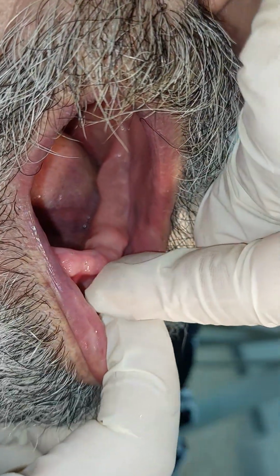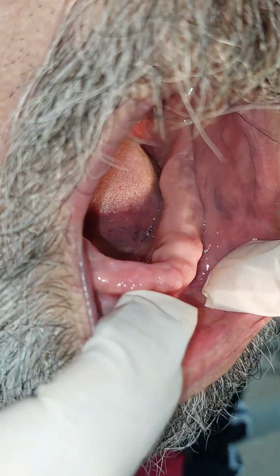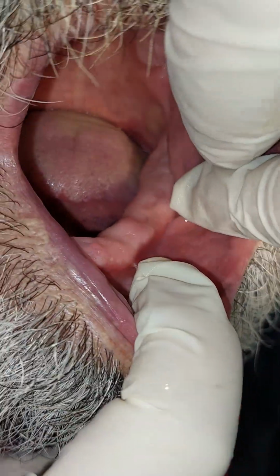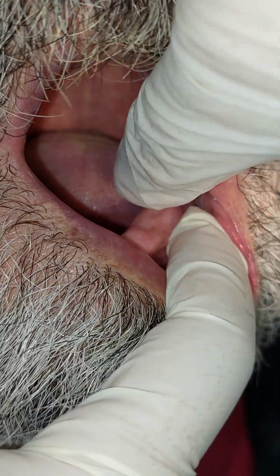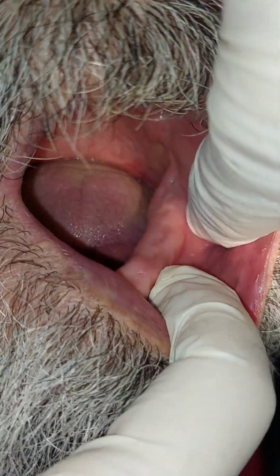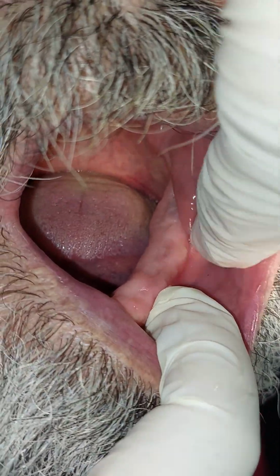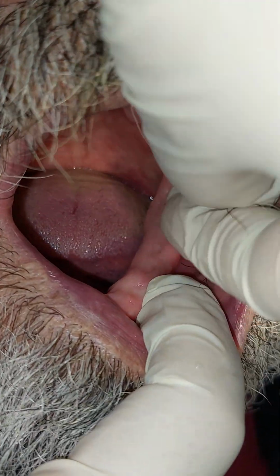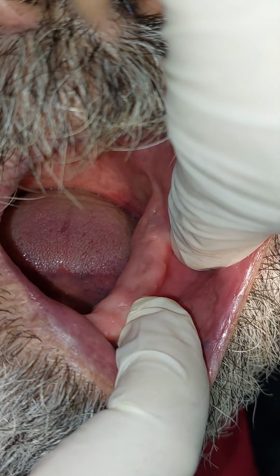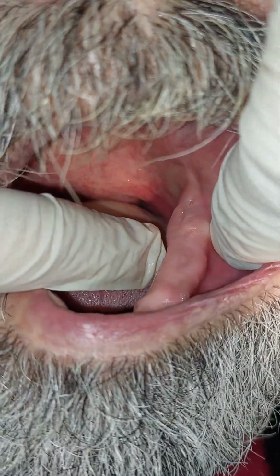If you see the previous videos, you will know it, but let us concentrate on it. See how the undercuts are present anteriorly. They're going to the lateral. If I shift like this, see them under the premolar. Even under the molar area, there's an undercut. There is a bony undercut here. See it? And then even if we go buccally, this is not an area of undercut. In this case, there's a very slight one. But more than that, lingually to the teeth.